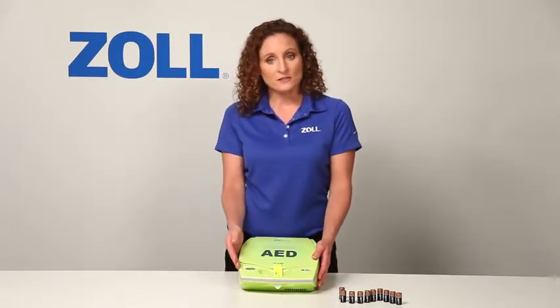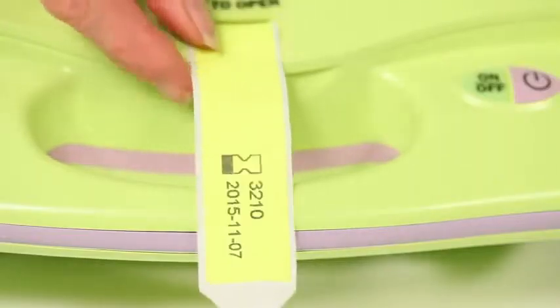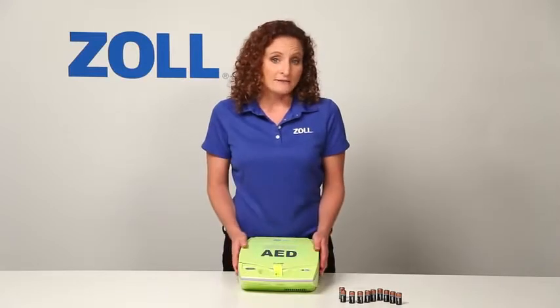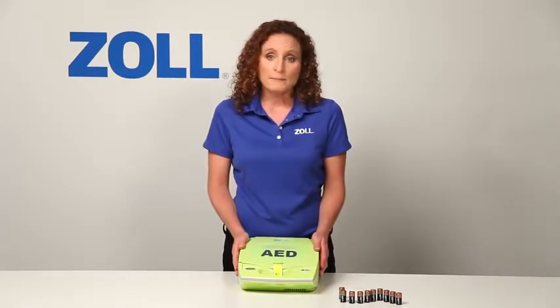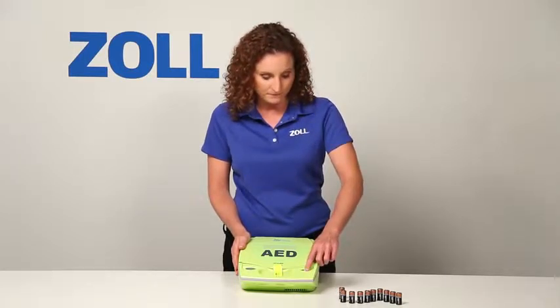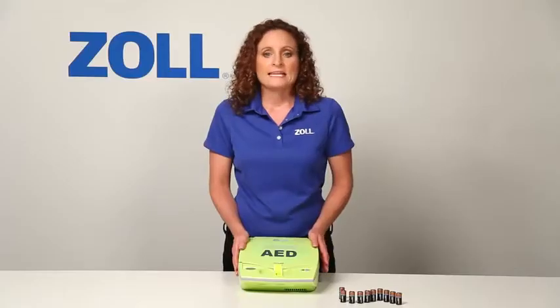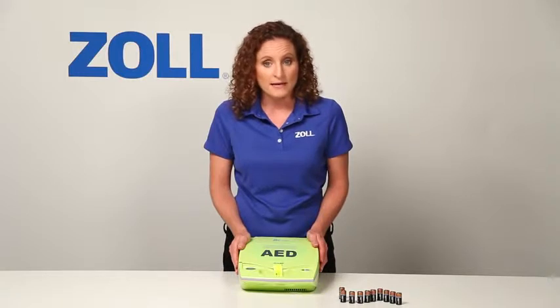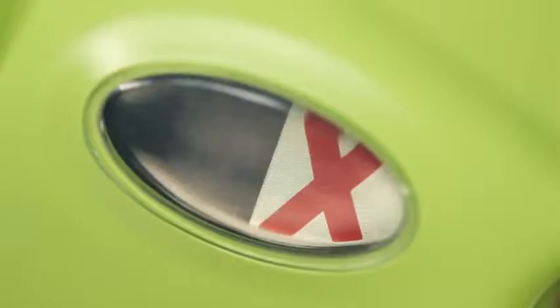Notice how easy it is to inspect the readiness of the AED. Check the expiration date of the pads by looking at the date printed on this tag that extends from the lid. You can conduct a self-test of all critical components by pushing the on-off button down and holding for 8 seconds. Unit OK. The AED Plus performs the same test automatically on a regular basis and presents a green check in this window if it passes, or a red X and a beeping alarm if it fails.